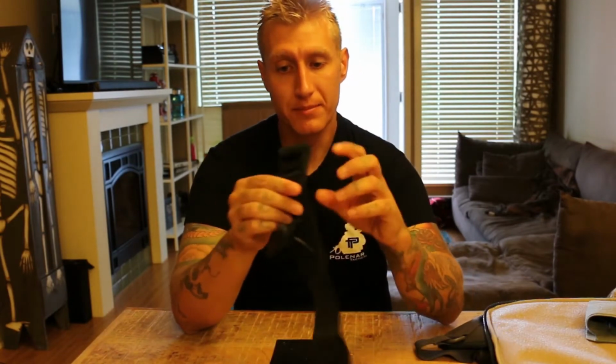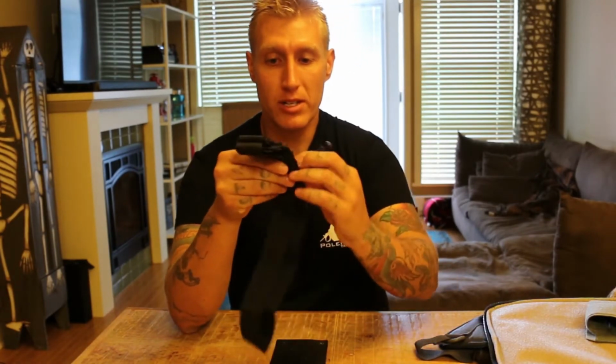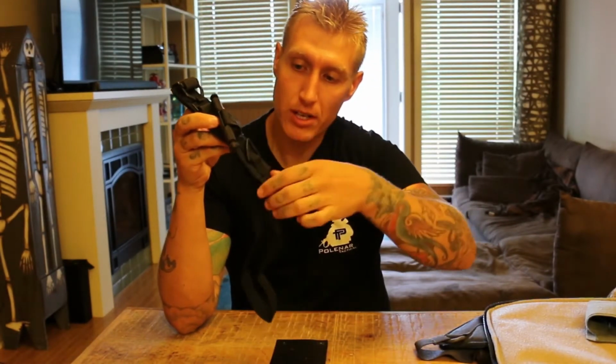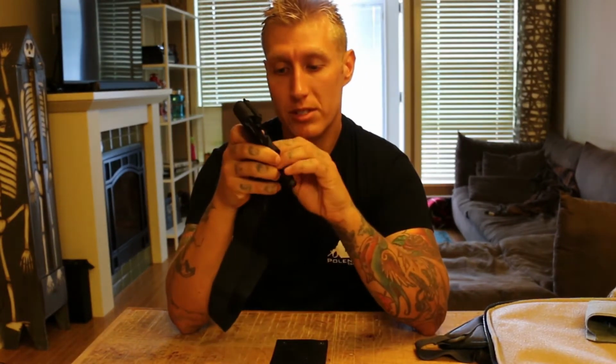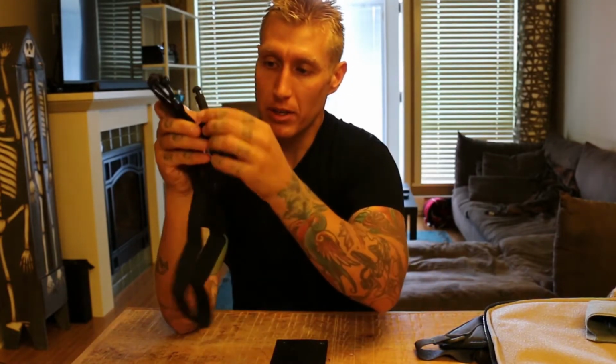So once that's done, I'm going to take my windlass, and because it slides free on one side and not on the other, as you can see it's stitched here, but through here it actually goes through this tunnel and I can pull it tight there. I'm going to need some slack here so I can fold it over and off to the side of the tourniquet. So what I do is I pull it up and I bring it over to the side.